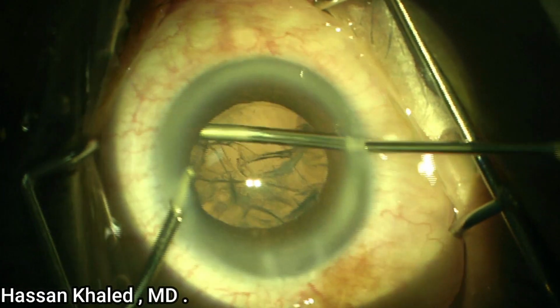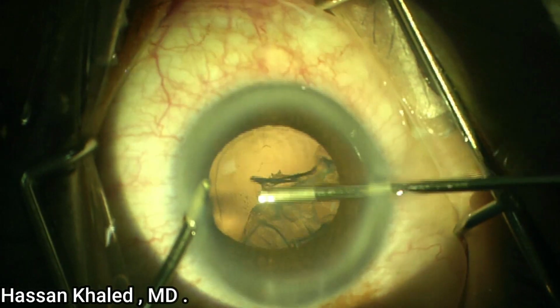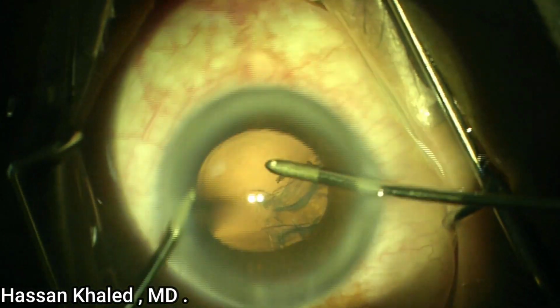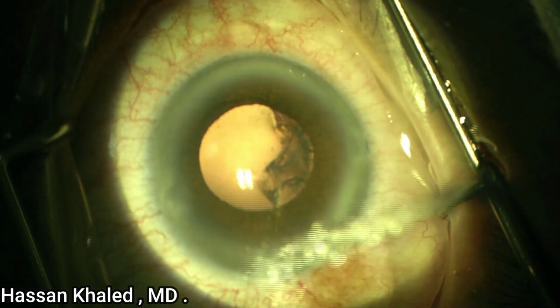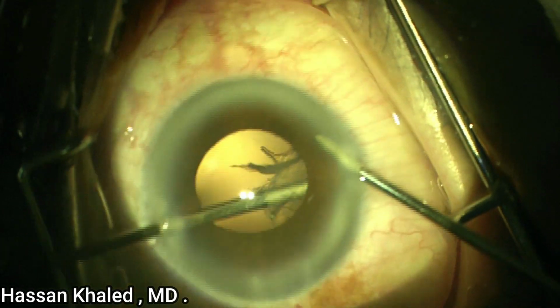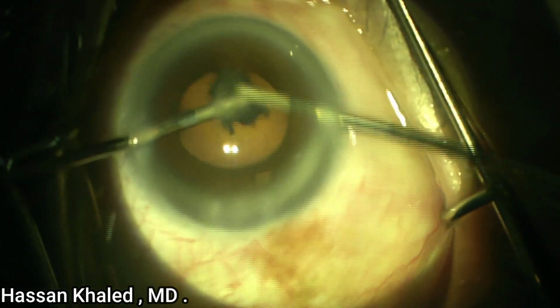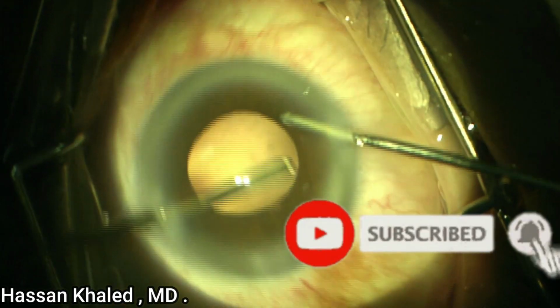You can see here also I am twisting the side port where the irrigation probe enters. In this way you can fix the eye while removing the cortex, and at the same time you can prevent the leak around the irrigation probe. You can see here also the twisting of the paracentesis. In this way you maintain the intraocular pressure inside the anterior chamber, and you can prevent collapsing of the anterior chamber, and also you can fix the eye while removing the cortex.